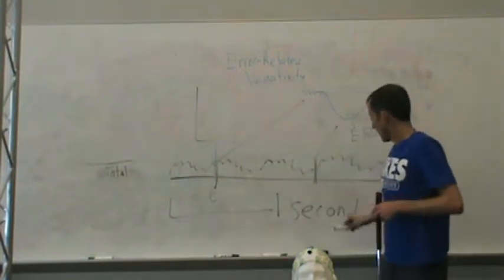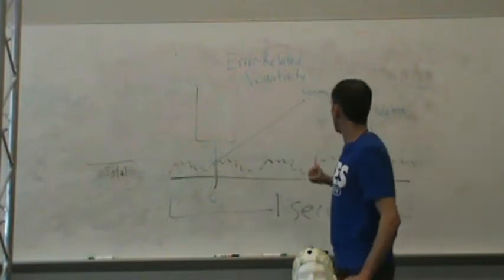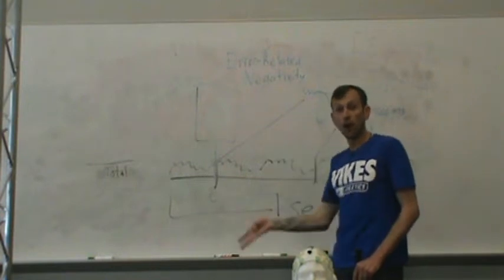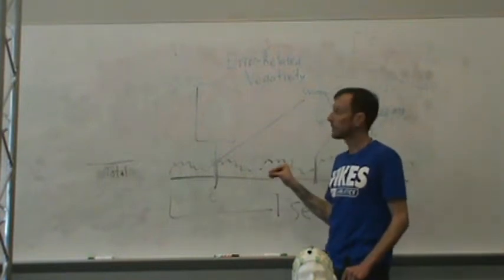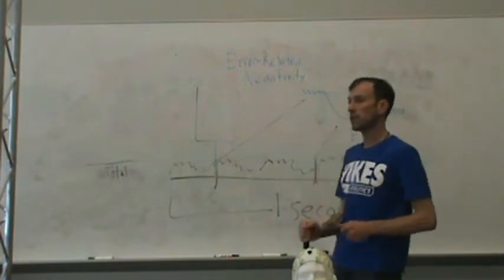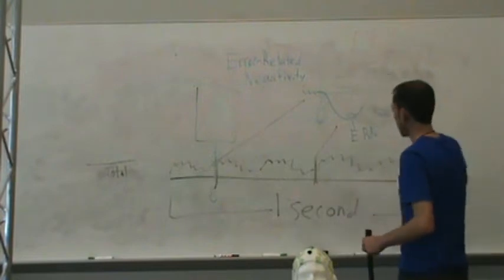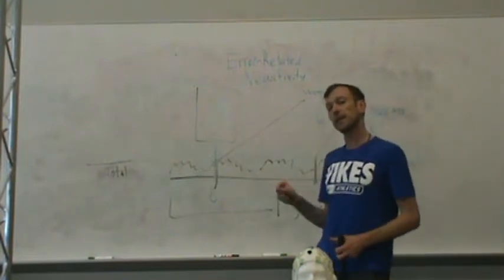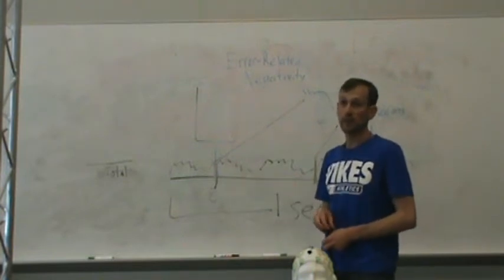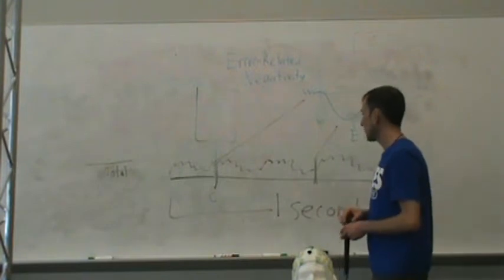Now, as the name suggests, this is going to be a negative going component, or a trough in our ERP wave, and it's going to be related to an error. One thing I didn't mention is that the event that causes the event-related potential doesn't necessarily have to be a picture or a sound. It could actually be a response. And that's what the error-related negativity is.